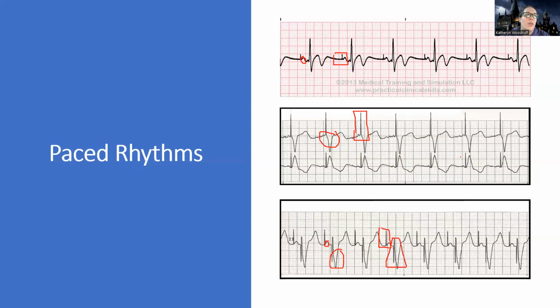When someone's ventricular paced, it's not their own heart that is sending the signal. When the pacemaker sends the signal, the rhythm's going to look a little different. I'm not going to get into deep electrophysiology about why, but it's common, normal, and expected for a person with a paced rhythm, especially ventricular pacing, to have a very wide rhythm.